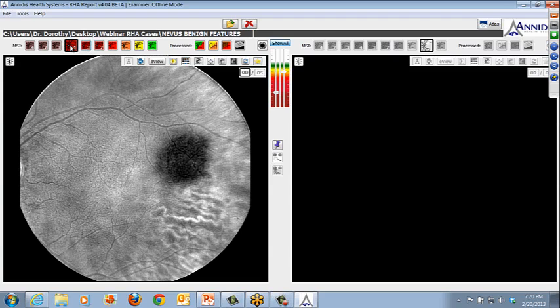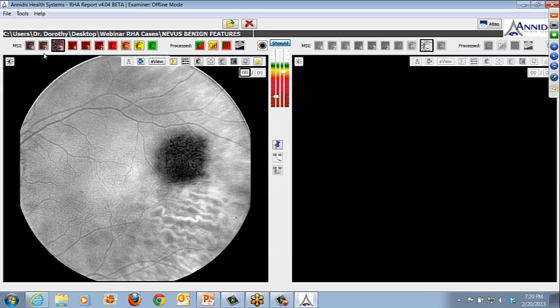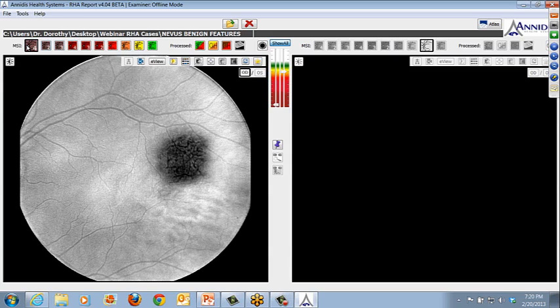So that's not too unusual. I'm going to show you. But again, highly regular lesion. The pigment is regular. It's not 100% smooth, but it's regular. Okay, and it will start to fade as you get down into the choroid. So it's a highly persistent, consistent lesion.